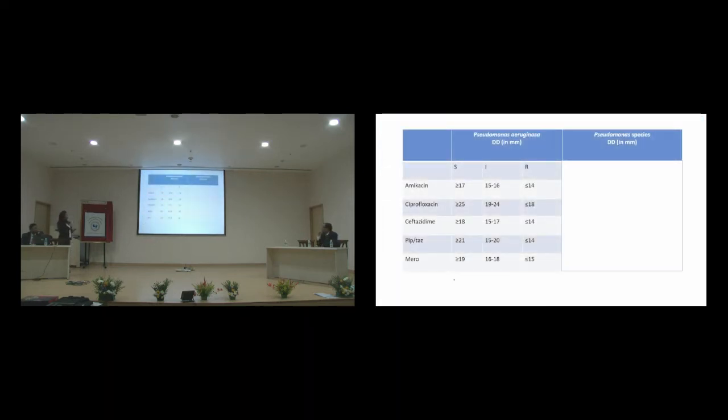So what is a breakpoint? Is it different when you report Pseudomonas species other than Pseudomonas aeruginosa, the putida group or fluorescens group or stutzeri group? Is it the same breakpoint or is it different? How many of you report disk diffusion for other than Pseudomonas aeruginosa? Are there disk diffusion breakpoints available for other than Pseudomonas aeruginosa? Disk diffusion breakpoints are not available. Tell honestly, how many of you report?